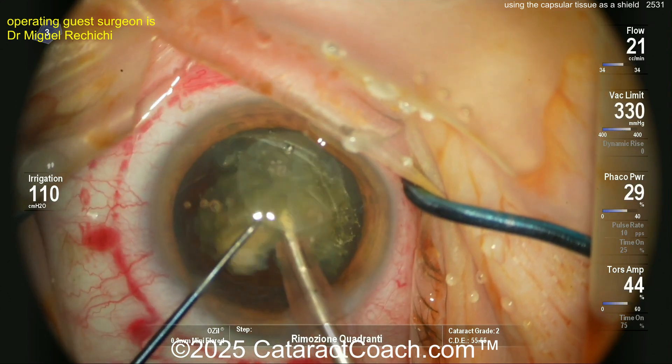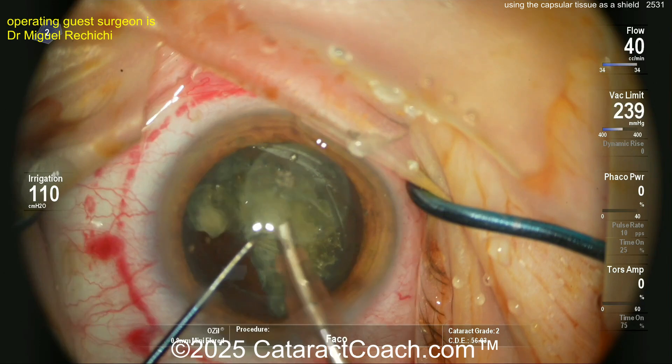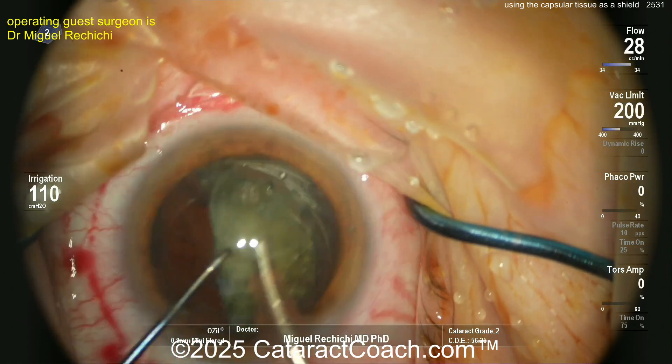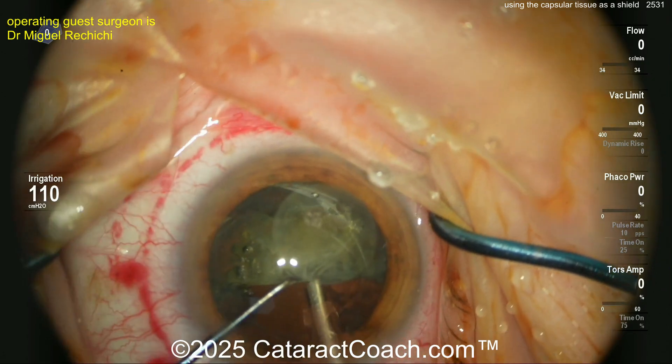It's a little bit of a shield — something I've never seen before and never even thought of doing. I don't know if it's absolutely necessary, but when it was described to me, I thought that's an interesting idea. In a case like this, I would normally take that central tissue of the capsule and just get it out of the eye. But here the surgeon is leaving it up against the corneal endothelium as a shield or protection.